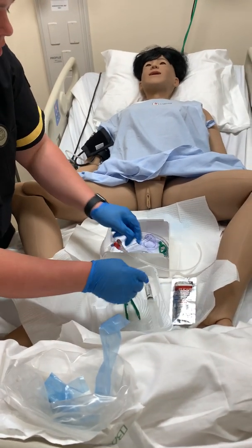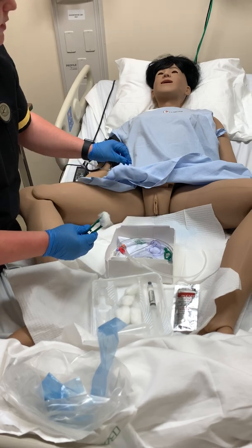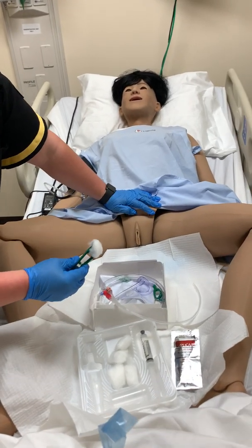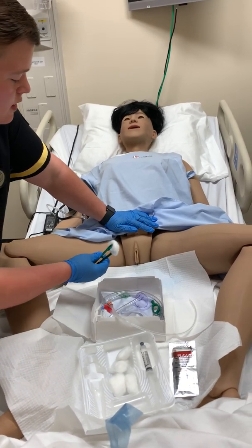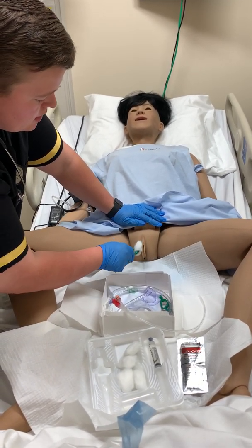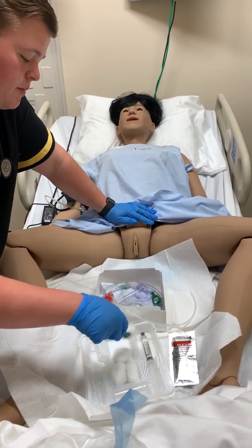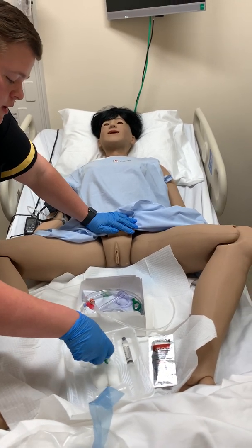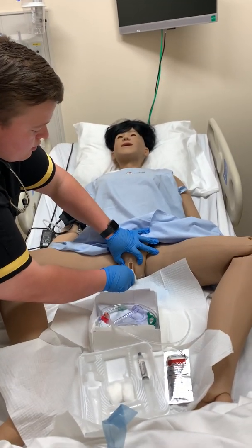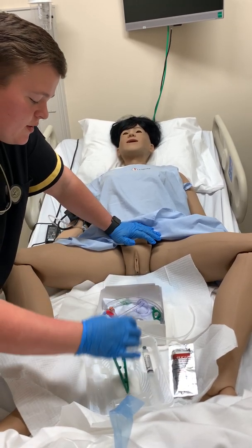All right, and so the next thing we're going to do is sanitize this way. And now this hand is no longer sterile, so we'll have to keep it here. We can no longer touch any of this equipment. And so we are going to go ahead and start to clean. You'll wipe one side of the labia, drop, grab another one. The other side, drop, and then you'll spread, wipe down the middle, and drop. And you're done with this for now.